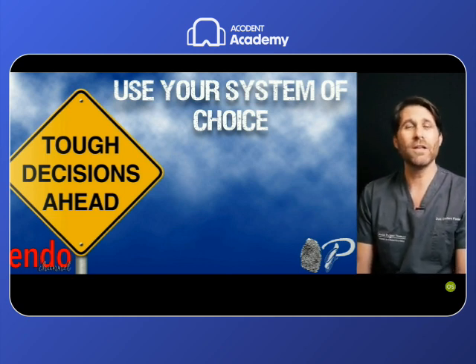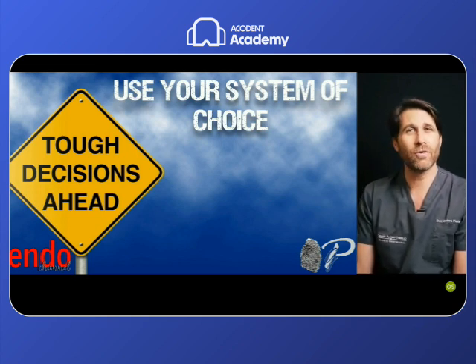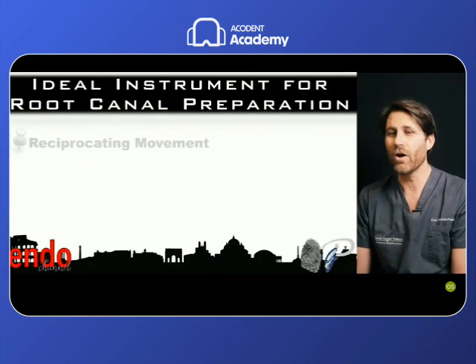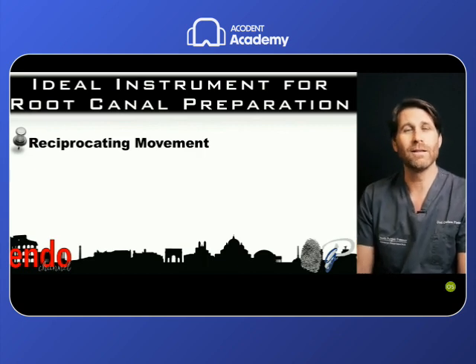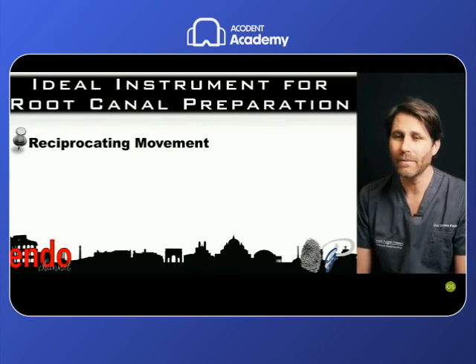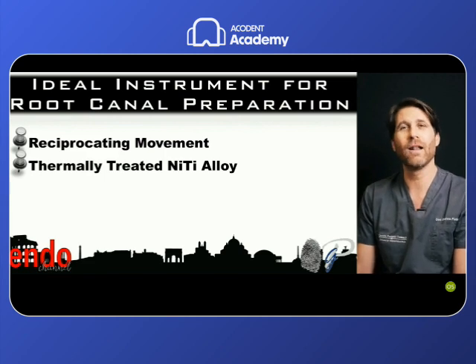we have a lot of very performant instruments on the market, mechanical files, both rotary and reciprocating, with very good mechanical properties that can easily prepare this kind of standard root canal, honestly. But my instrument of choice, which I have already anticipated and described in great detail in the lesson on the ideal instrument for root canal preparation, is a reciprocating file, because of all the advantages of reciprocation, and is a thermally treated nickel-titanium alloy file, because of all the advantages that we have described on this topic.